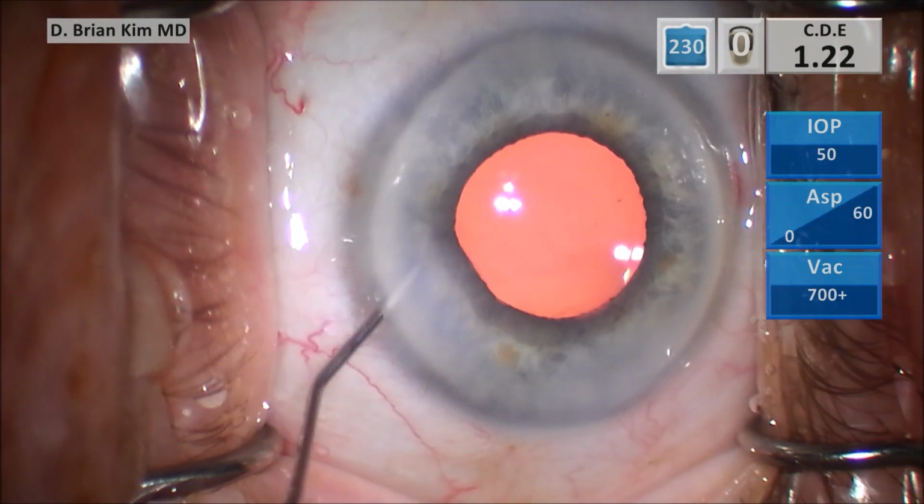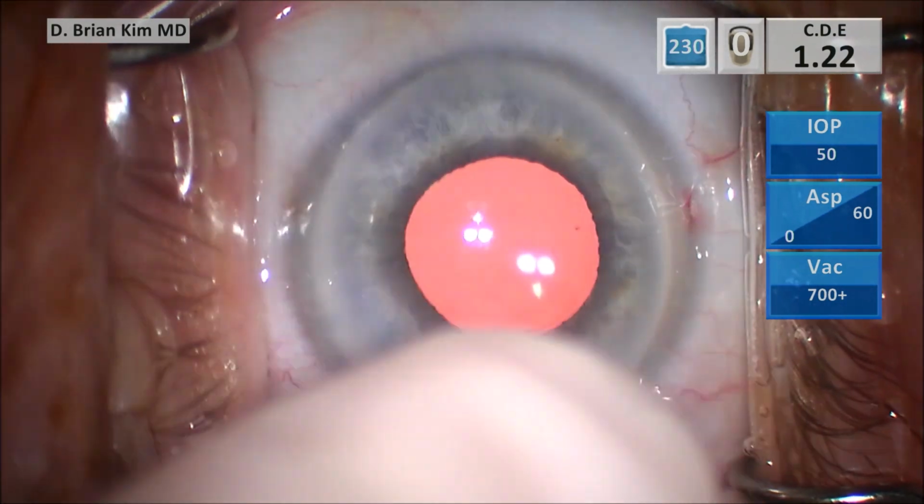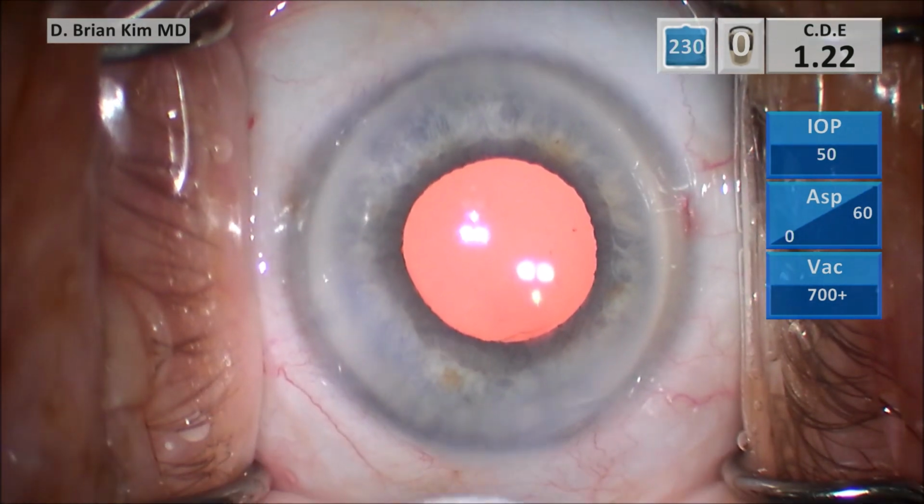And so I do this routinely with all the cases. I never worry that I'm not able to take a lens piece out. So I really do feel like this is the best way to do cataract surgery when you're dealing with a small pupil and a soft lens.